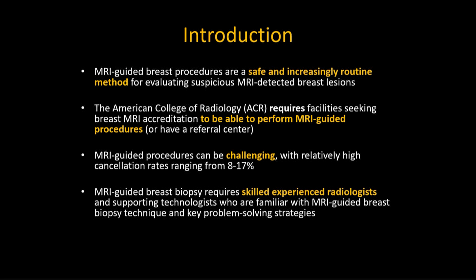So MRI-guided breast procedures are safe and increasingly routine method for evaluating suspicious findings on MRI. The ACR actually requires any facility seeking breast MRI accreditation to either be able to perform their own MRI-guided procedures or have a referral center.